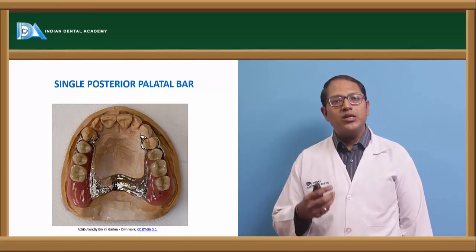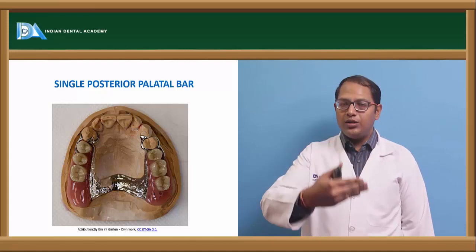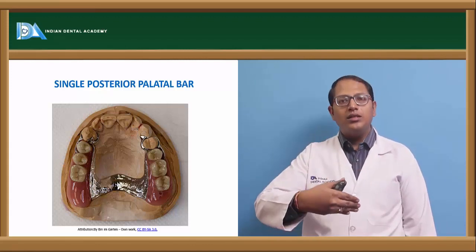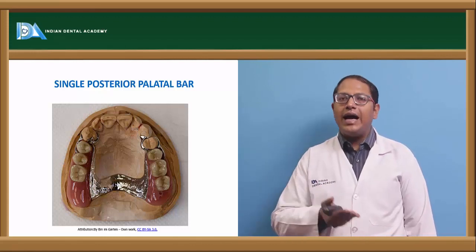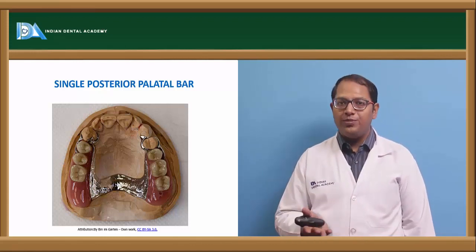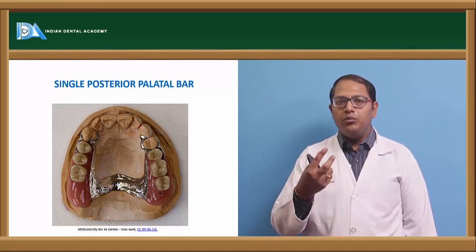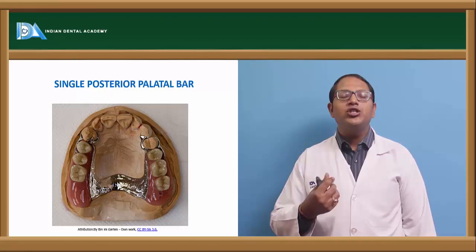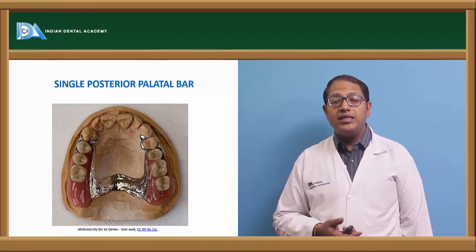That support is also applicable from the junction of the palate towards the tooth or teeth. The juncture between the palate and the teeth, where the major connector follows, should be not sharp and as smooth as possible. That will give more support and retention due to this L-beam effect. We'll come to that later. Now, where is it indicated?